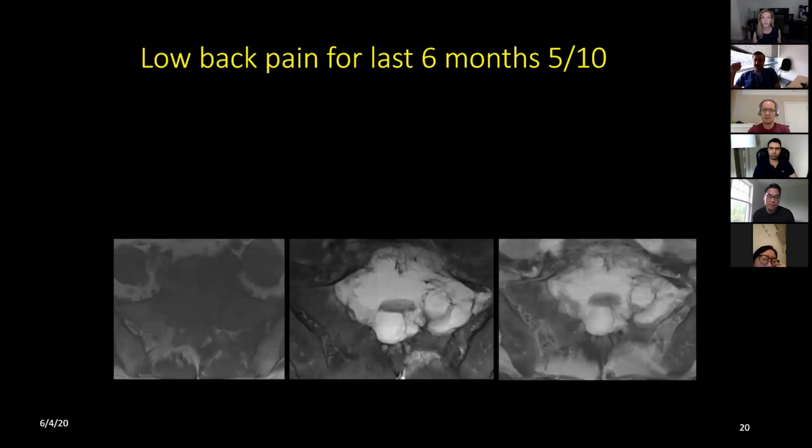So I think this is very interesting. The situations where we use a lot of these different types of sequences are when we're really looking at spinal vascular malformations. That's probably the most common situation. But for tumors, not. I'm very interested by this. This is really fascinating. Like Dr. Khan said, it's been around a few years, but it was kind of stuck in Sloan Kettering because not many people can replicate the results. But it sounds like at Hopkins you're doing it, so that is very exciting.